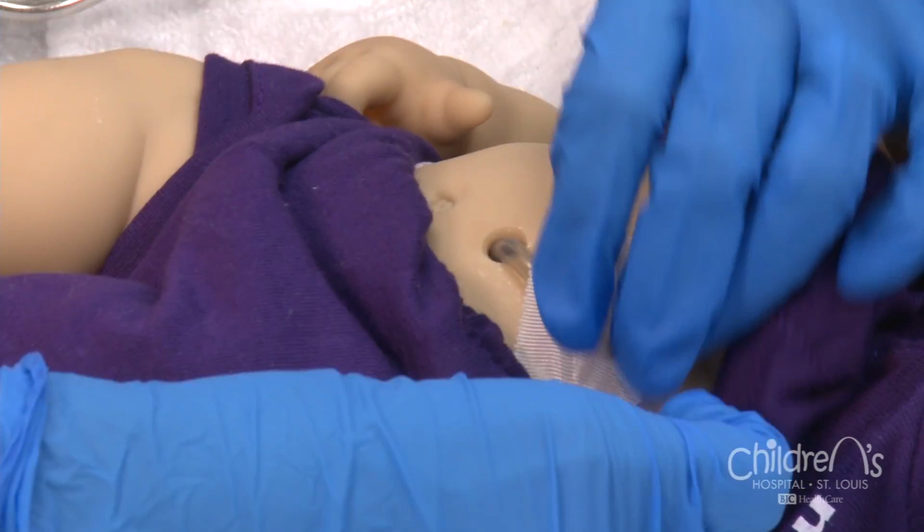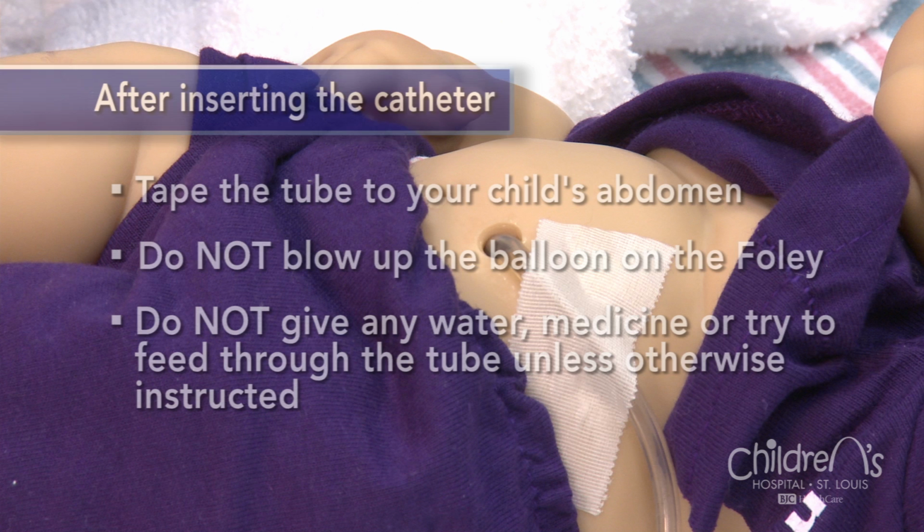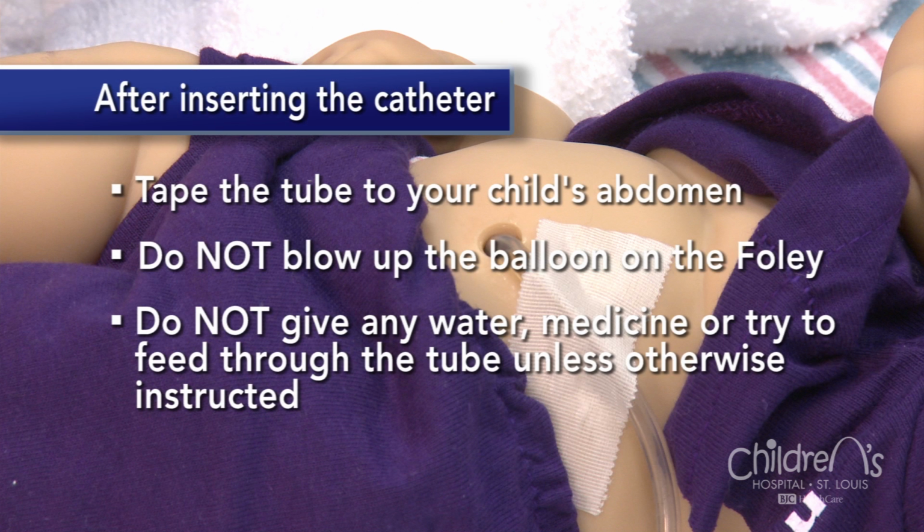Once the Foley catheter is inserted, tape the tube to your child's abdomen. Do not blow up the balloon on the Foley. Also, do not give any water, medicine, or try to feed through the tube until cleared by a general surgeon.